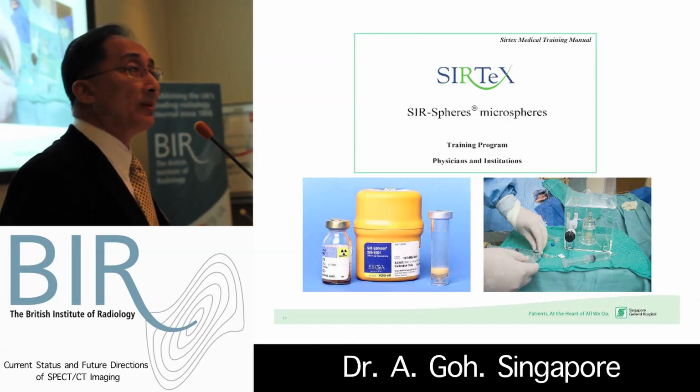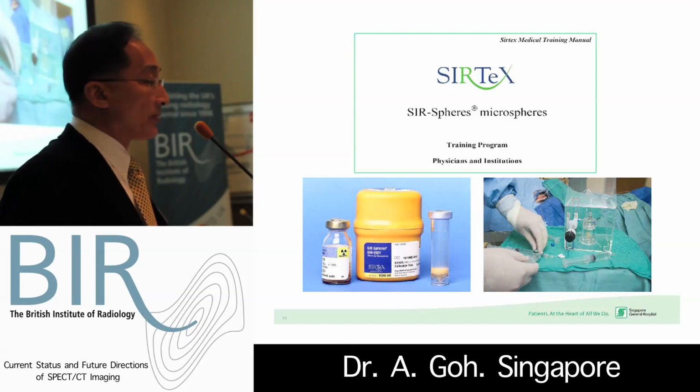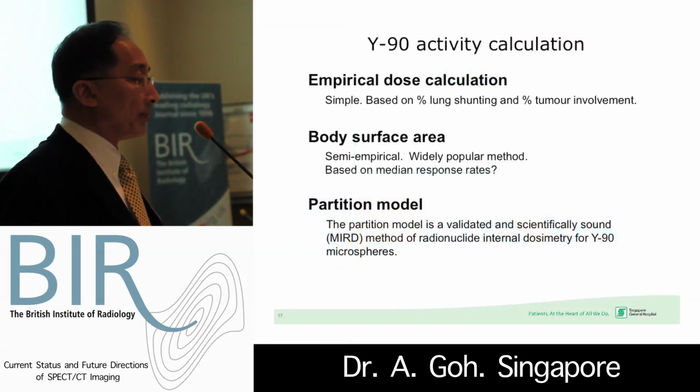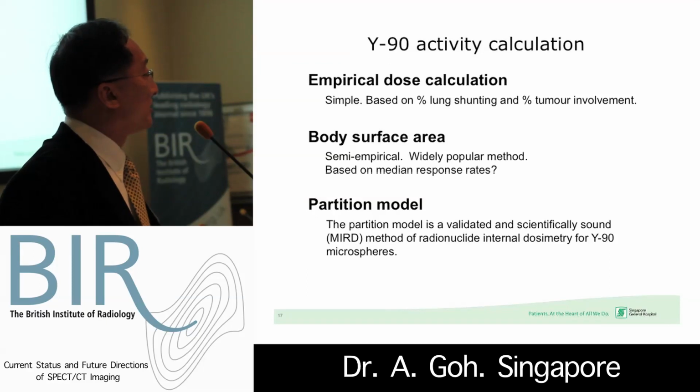that generally gives most treatment centers the instruction manual, the training manual that guides therapy in most sites. And the training manual suggests three methods for pre-treatment planning. The first is the least scientific and seldom used.